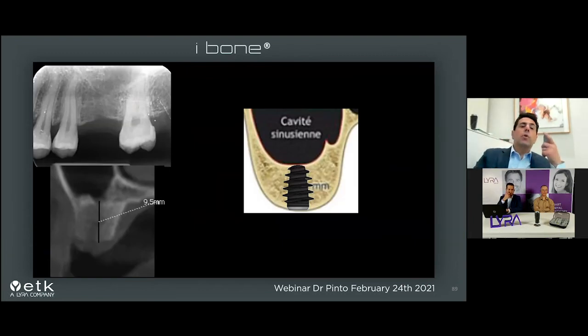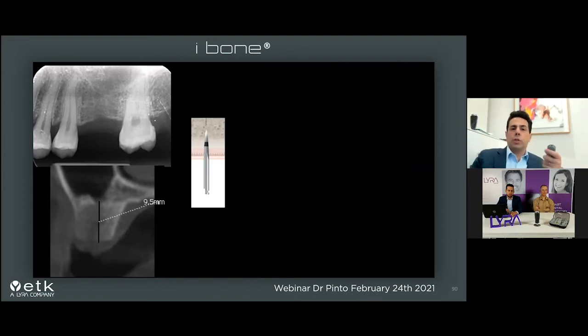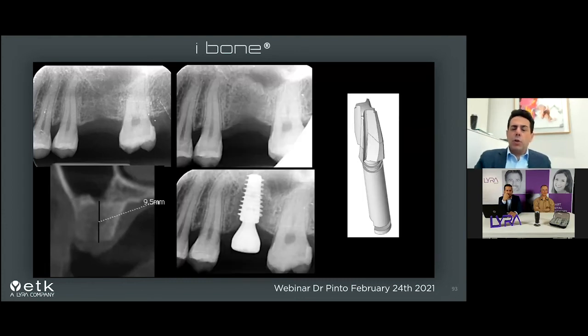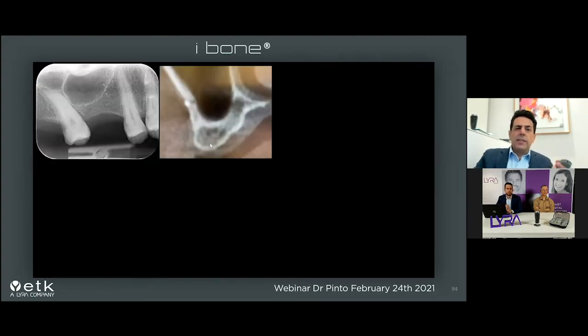Obviously, we can start to imagine more extreme situations. What does extreme situation mean? It means that in this case we have a very short level of bone for the implant, we would like to put the implant, but we don't want to put a very short one. So you decide to push, using the reamer in the anti-clockwise direction and pushing apically, and this reamer has an apex that is not working. It means it's not sharp. So you can only push the bone upward, and after, when you put the implant, you can keep all the bone that was inside, and you can push it under the sinus.